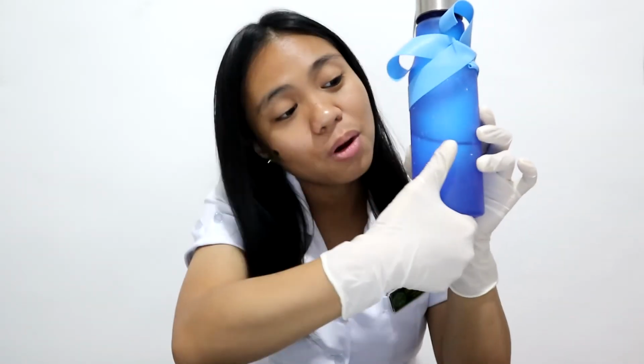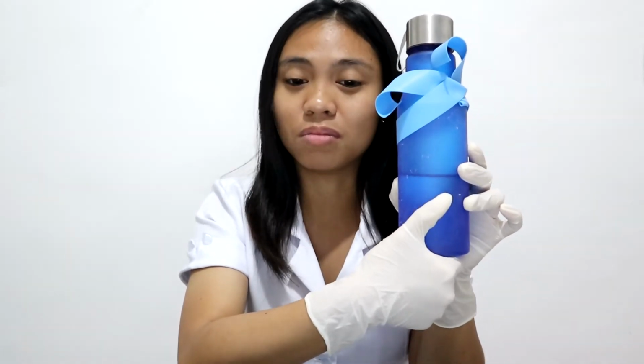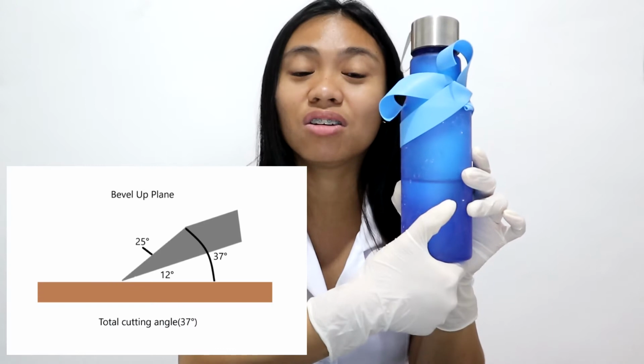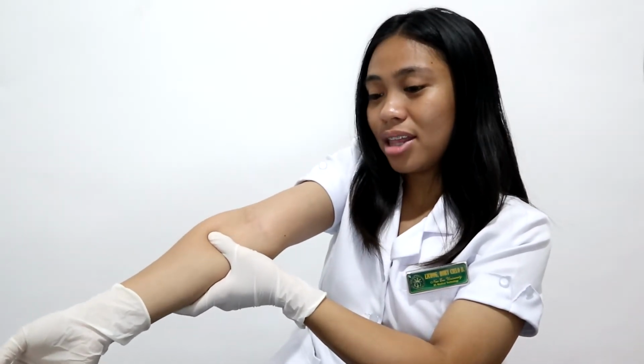So when you do the anchoring, you can now aim the syringe to the vein with the bevel facing you, the phlebotomist, at a 15 to 30 degree angle. So when you do it on the hand, let's say this is where our tourniquet is, you should anchor downward, then aim the syringe.